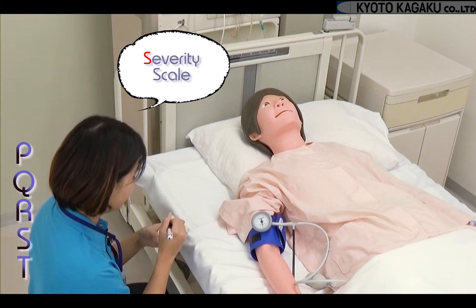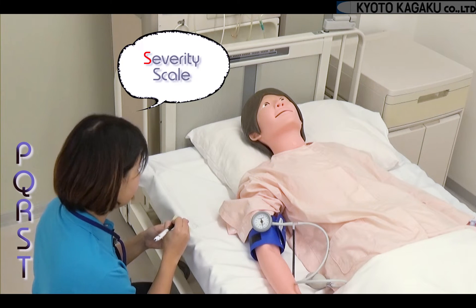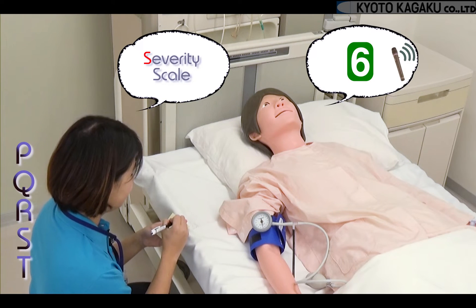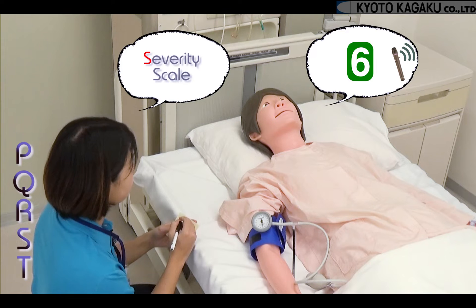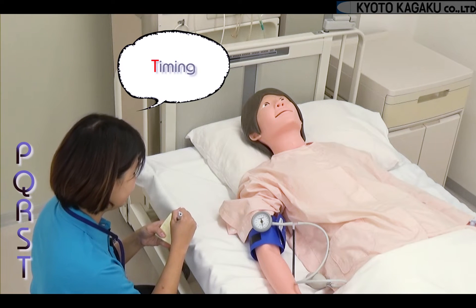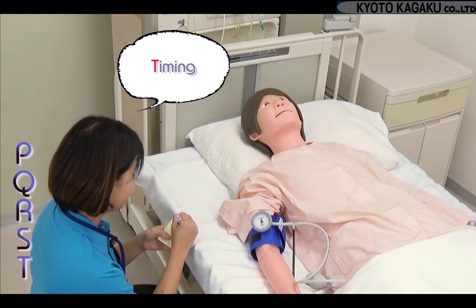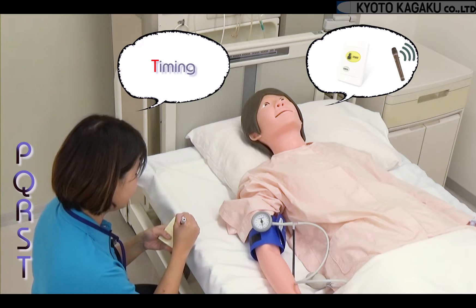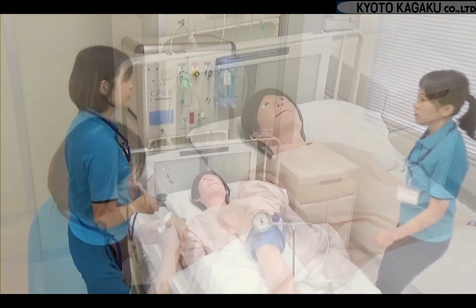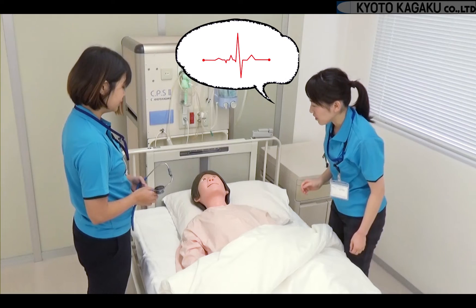What would you rate your pain out of ten, with ten being the worst pain you've ever felt? About six, but it was so scary. When did it start hurting? Is it still hurting just as much now? Just before I pressed the buzzer — it still hurts.